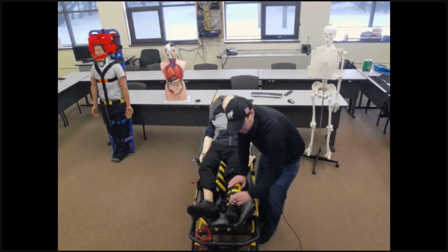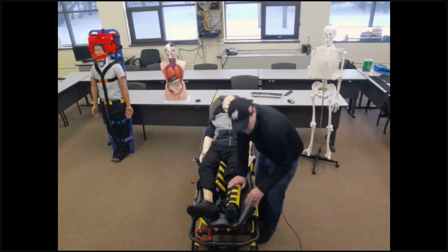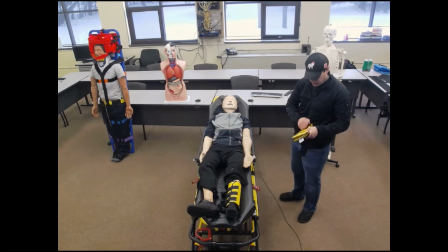Okay, so the pulse. Can you feel me touching you? What toe am I touching? And then go ahead and wiggle your toes. Patient wiggles their toes. Good. Perfect. Now, I'm going to secure patient's left wrist.